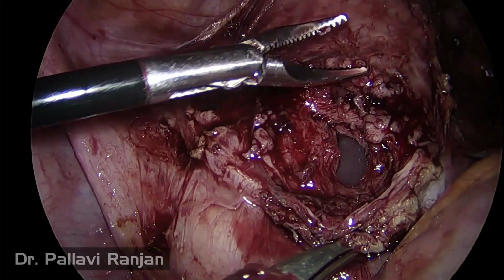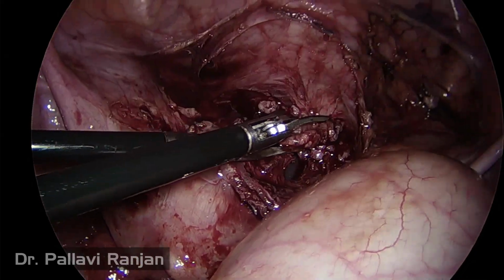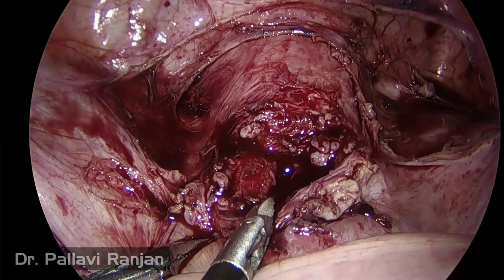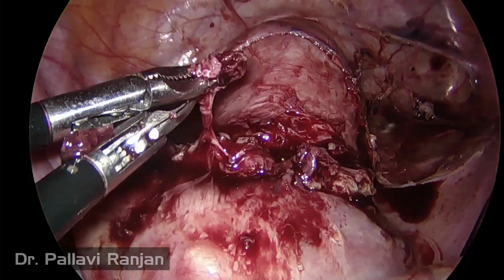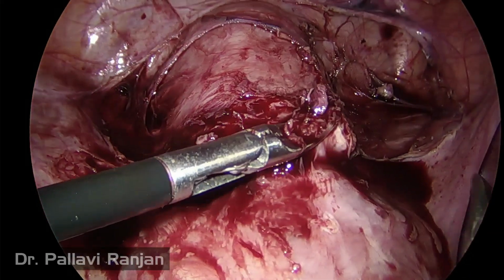Now we are refreshing the scar edges completely, the lower edge as well as the upper edge. The reason for refreshing the scar edges is, first, to get better tissue healing, better new scar formation. Secondly, once you refreshen the edges, you prevent isthmocele formation, by removing the lax tissue on which the scar pregnancy was located.